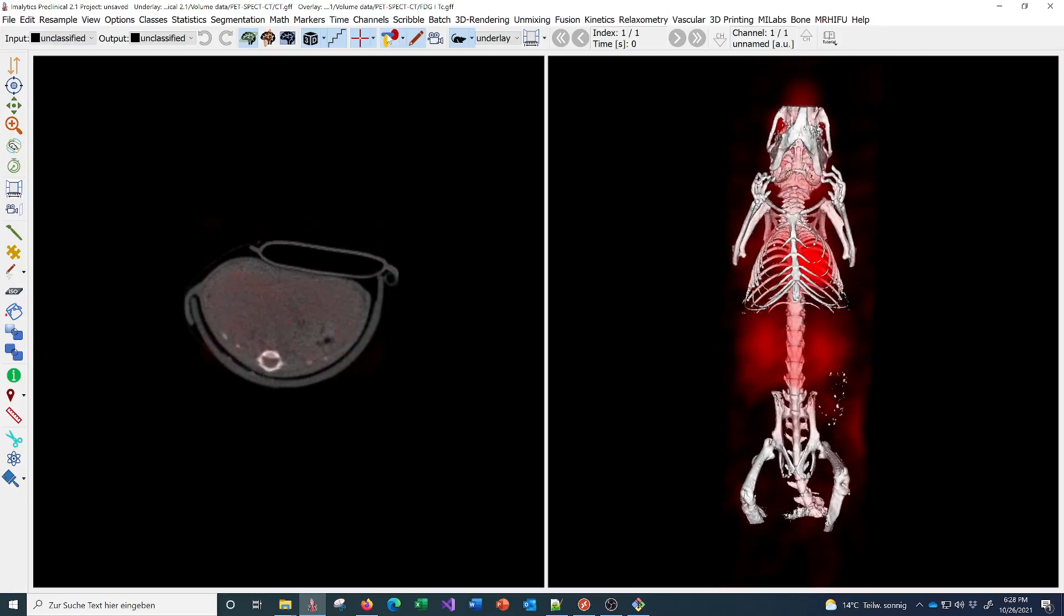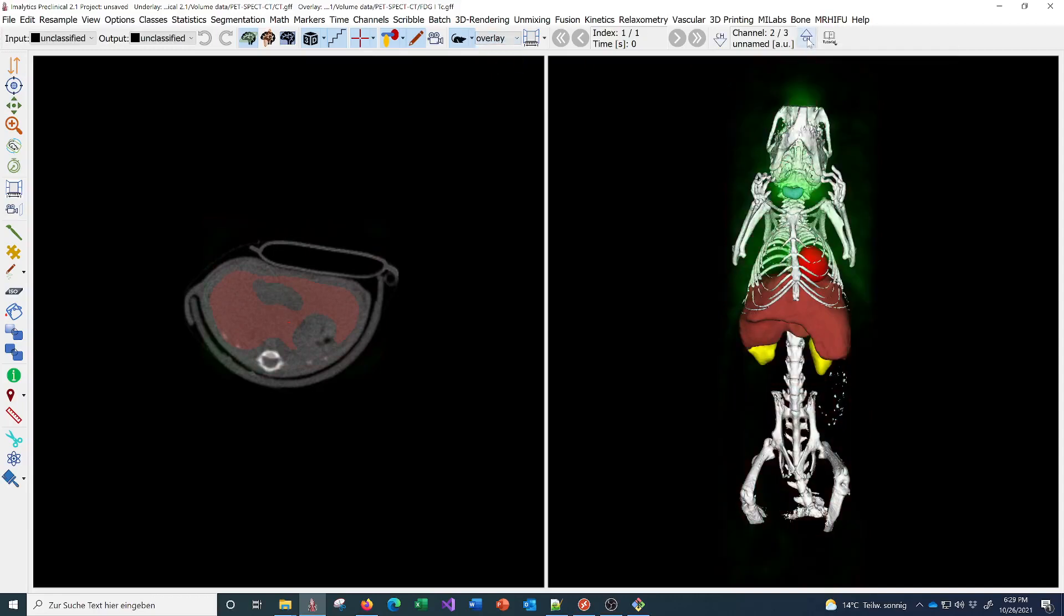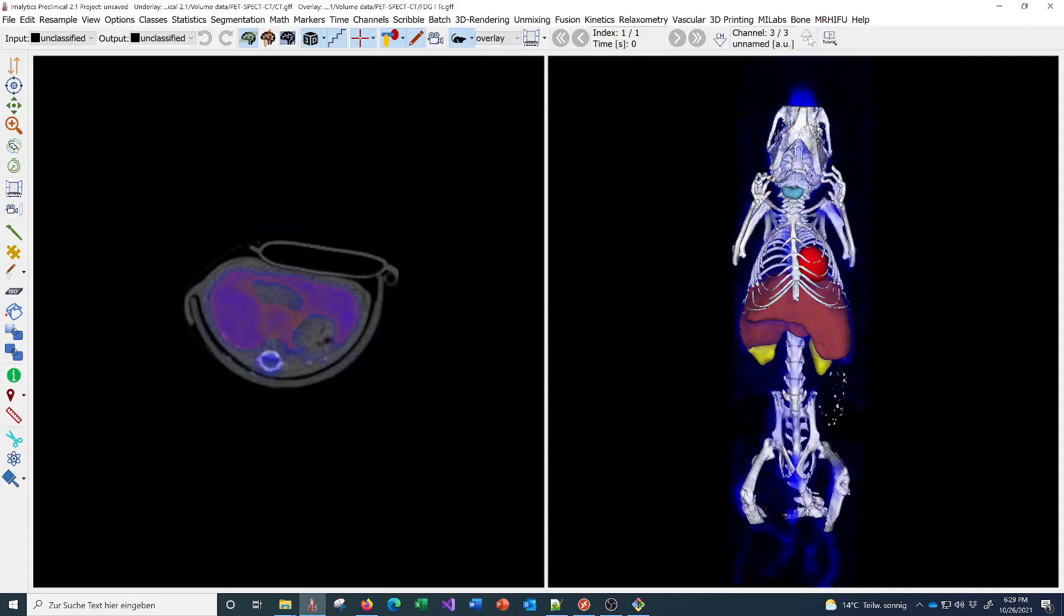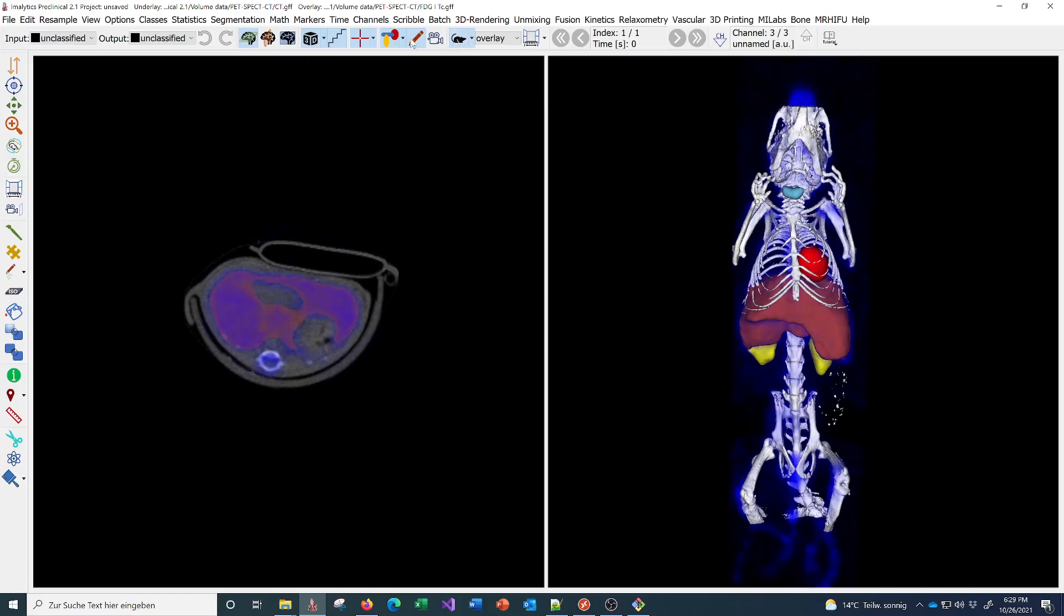In the overlay we also have multiple channels, for example iodine tracer here, and here a tracer that accumulates in bones and the liver. That's a technetium-based tracer.